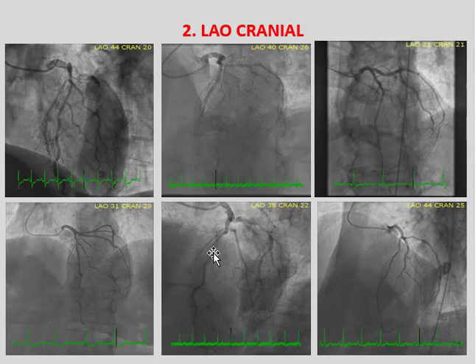And this is where you just need to identify your vessels. The LAD is long and straight, curving to the apex. That's a football coming out of the screen towards us a bit, but it's still in that elongated top to bottom view, standing on its head. So you will always have slightly different anatomical configurations, but you will learn these differences and they become much clearer when you see real films.